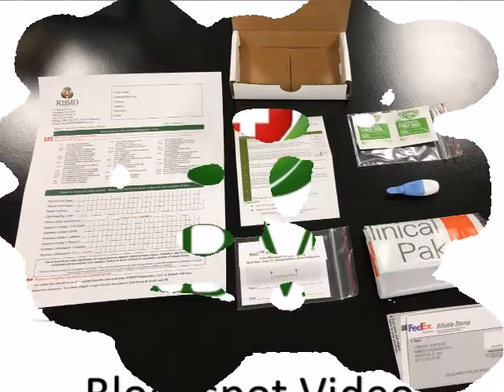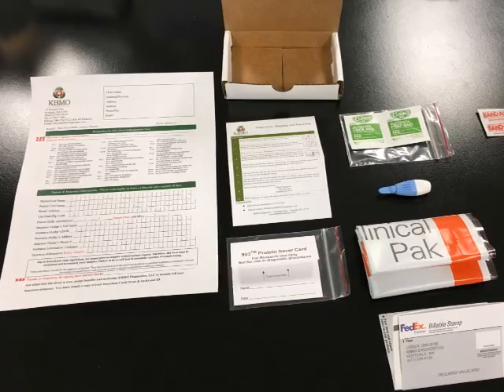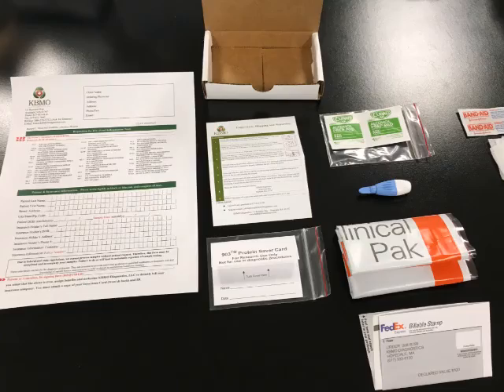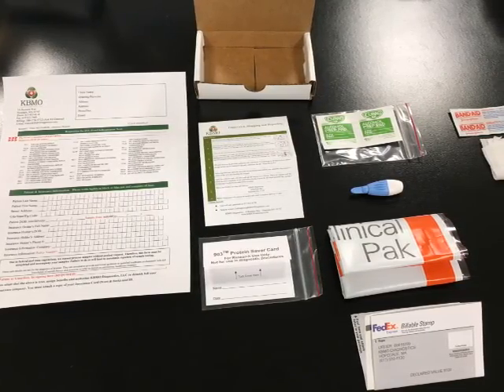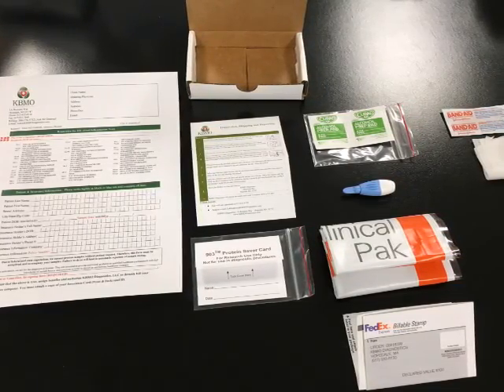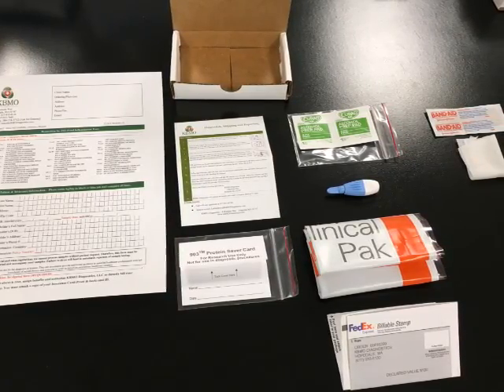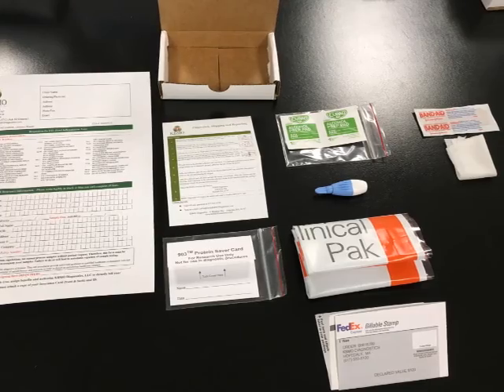First open your kit and ensure that you have the following: collection instructions, one protein saver card and plastic envelope, one alcohol prep pad, one sterile single-use lancet, one FedEx clinical pack envelope, and one prepaid billable stamp.